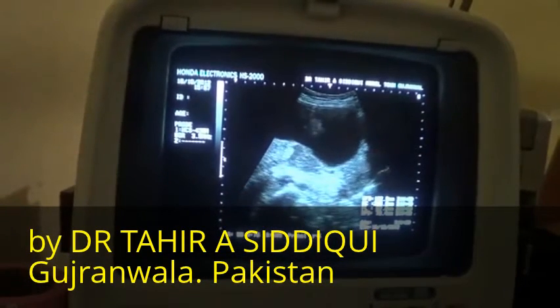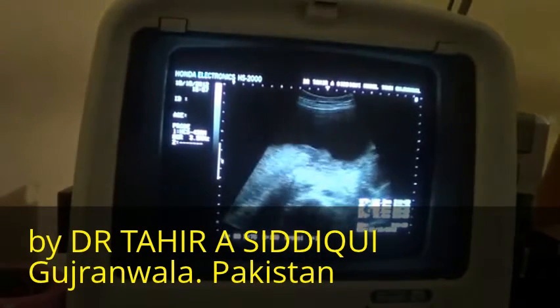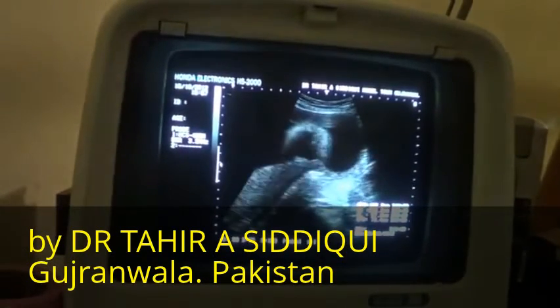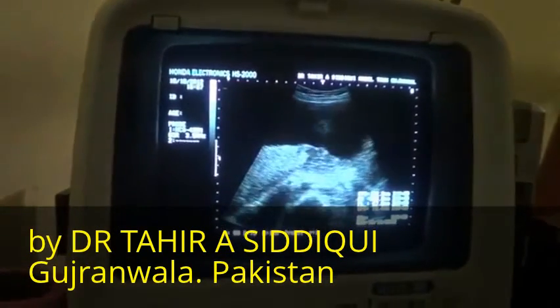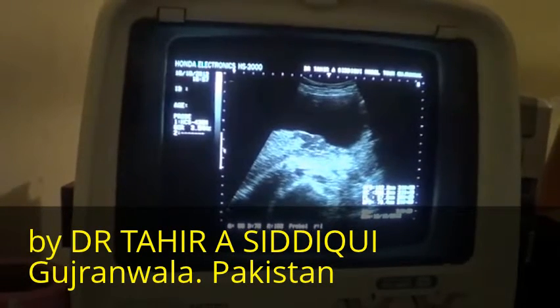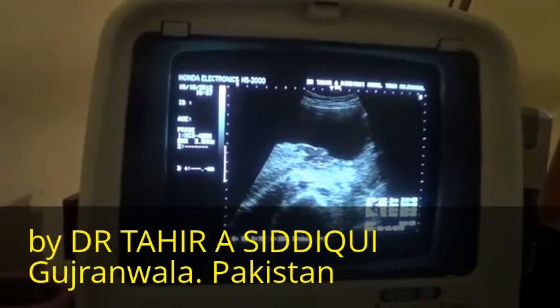So here what we are seeing is the cervix of the uterus. Now this is the cervix of the uterus, this area.